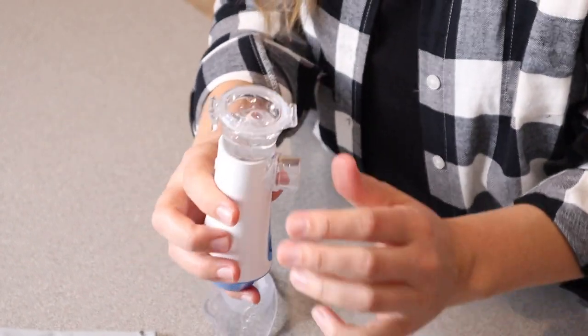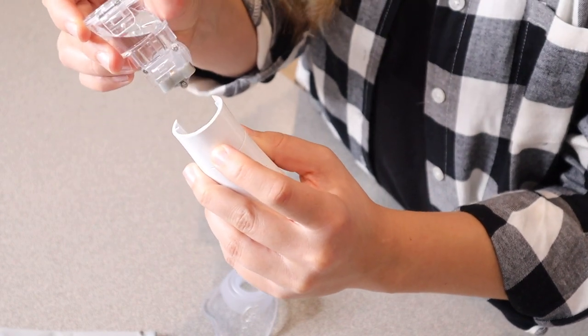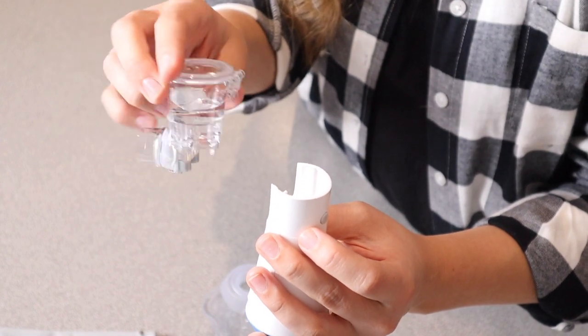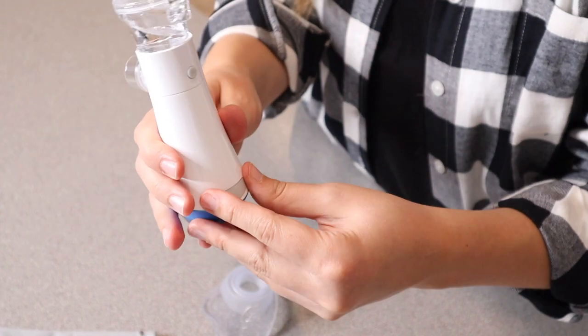I did want to show you there is a little disassembly feature on the back. You can push this little unlock button and this piece just pops right out for easy cleaning. Especially if you have things like medicine in it, you can easily wash this piece out without getting the entire nebulizer wet. And then it just clicks back into place and you're good to go.